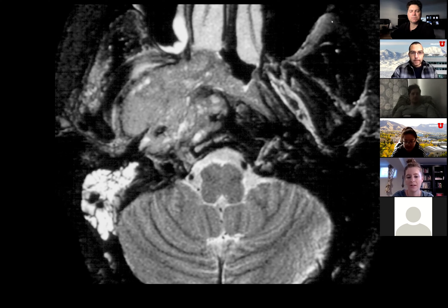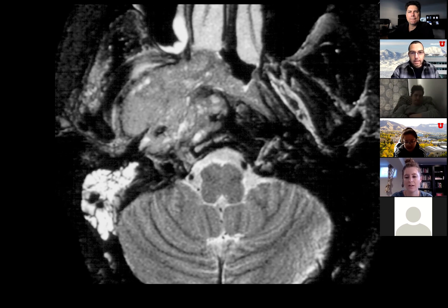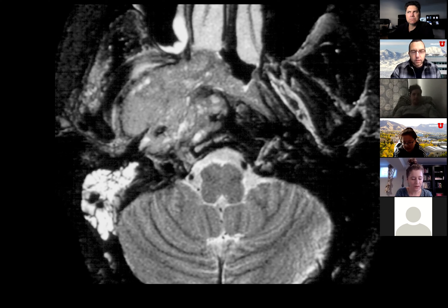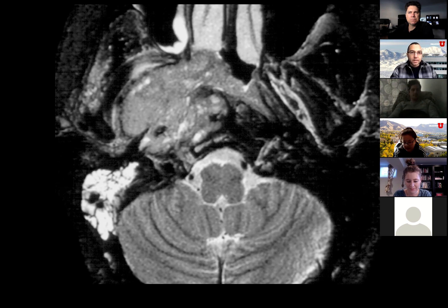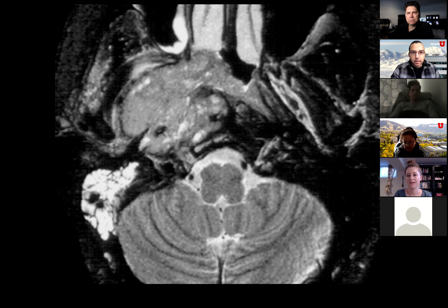We're looking at a T2 axial MRI. There's a large heterogeneous, heterogeneously hyperintense lesion centered in the right masticator space — or actually transpatial, but centered in the right masticator space.